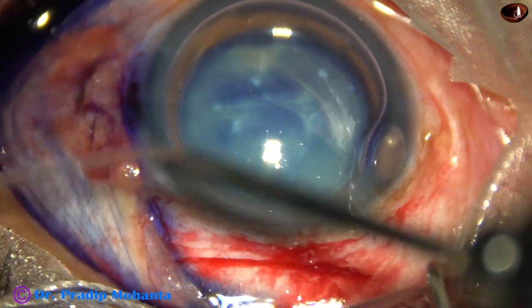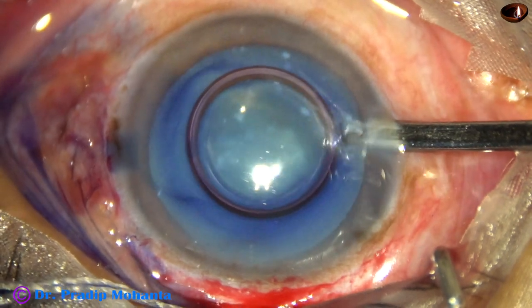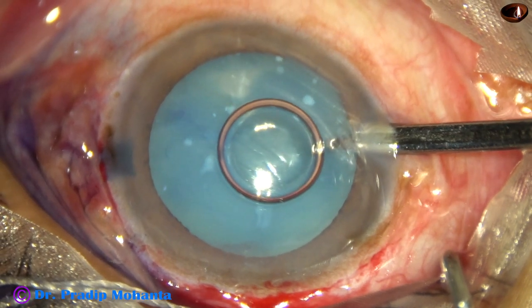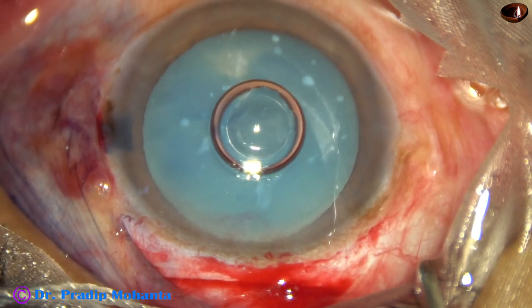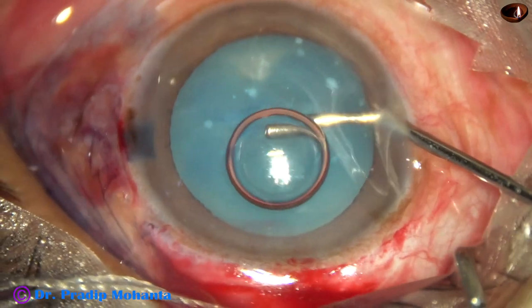The anterior capsule has been stained with trypan blue dye. See the appearance of the anterior capsule — the anterior capsule is fibrosed in the center and at 6 o'clock. So let us see what happens during capsulorhexis.